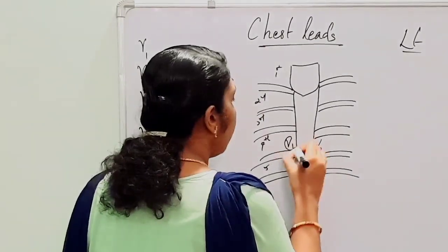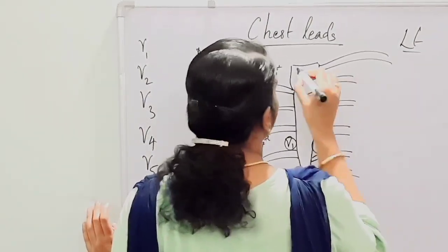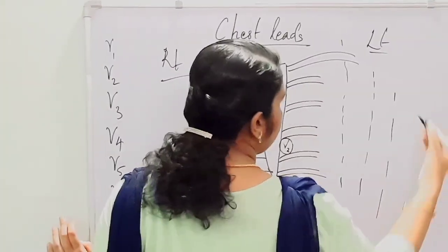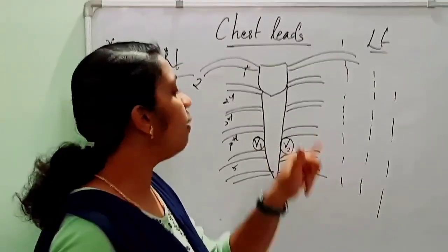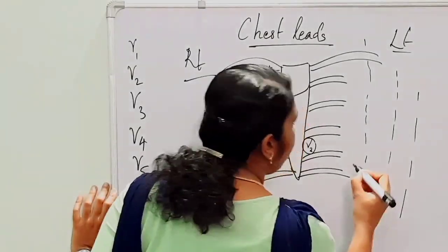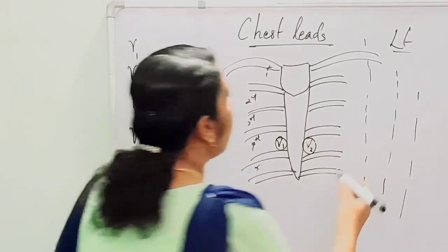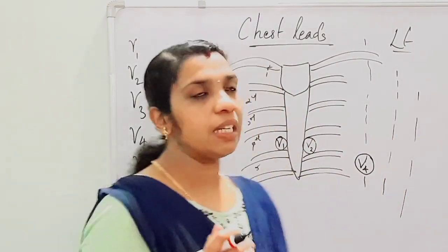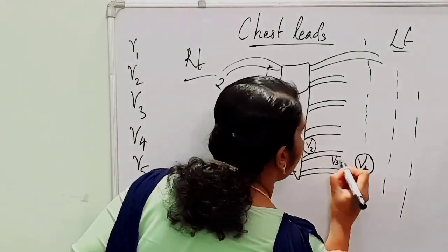We have placed V1 and V2. Next, we are going to place V4 — please be careful, we place V4 before V3. This is the clavicle. This is the midclavicular line, this is the anterior axillary line, and this is the midaxillary line. V4 is placed in the left fifth intercostal space in the midclavicular line. V3 is then placed in between V2 and V4.